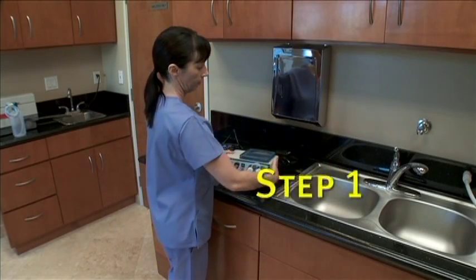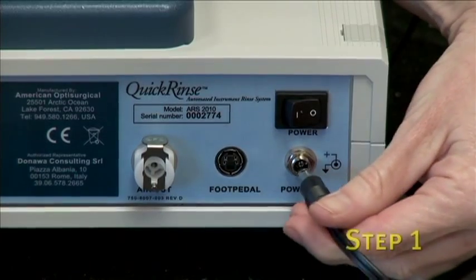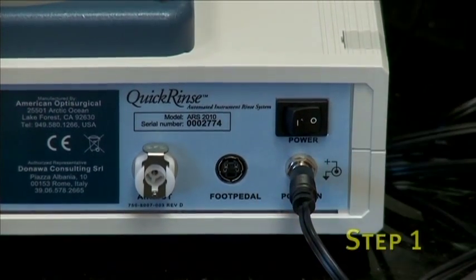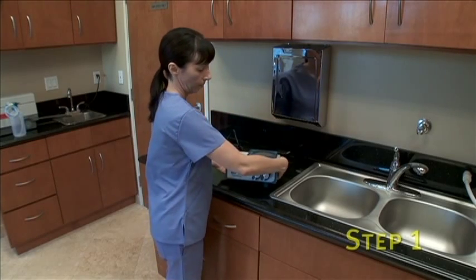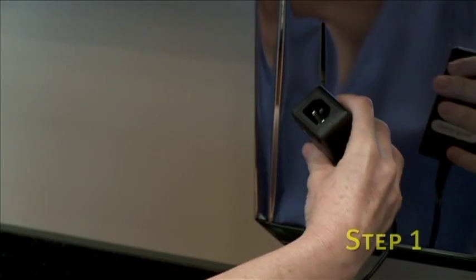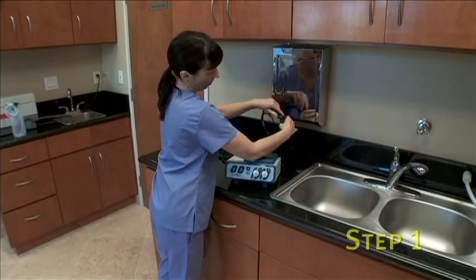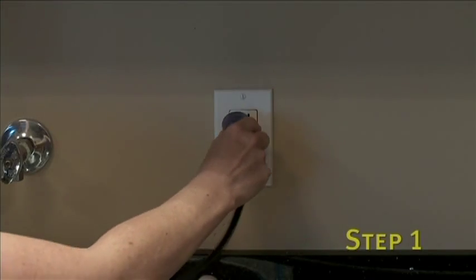The first step requires setting up the unit power. Take the power supply provided with the unit and plug it into the back of the Quick Rinse system, making sure the plug is fully engaged. Now plug the power supply into the hospital-grade power cord, which is also provided. Then plug the power cord into a grounded wall outlet.